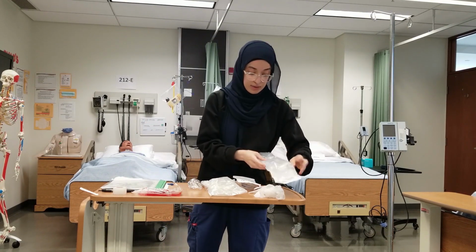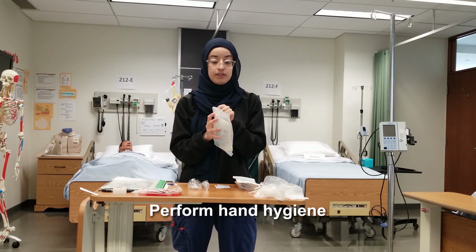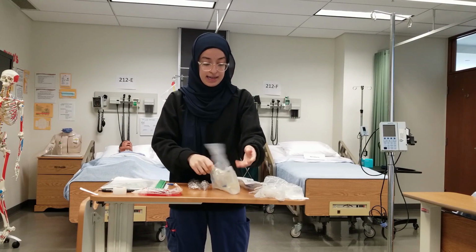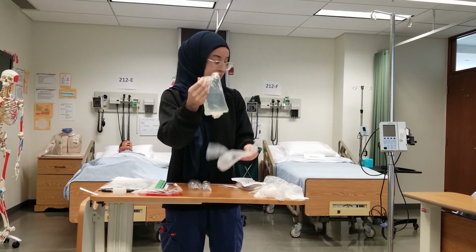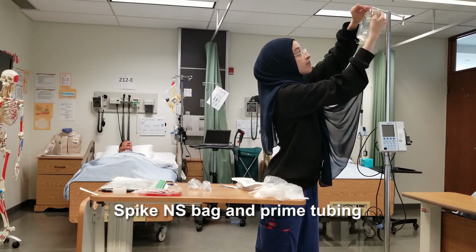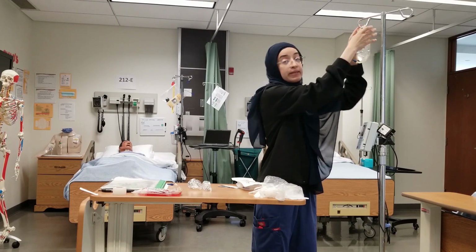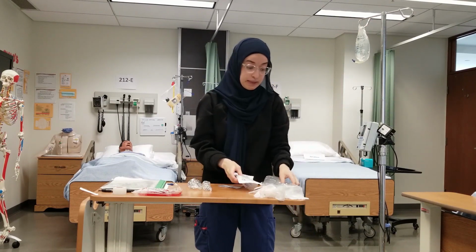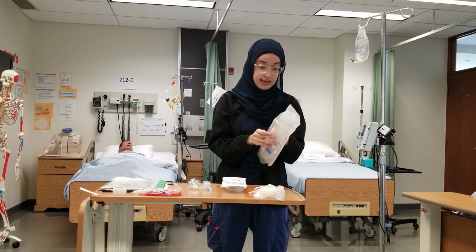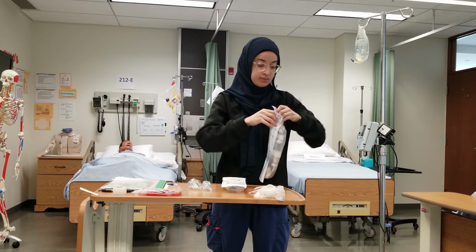So we're going to go ahead and get started. I've already performed my hand hygiene off to the side. I'm going to open up my NS and I'm going to hang it up. We want to make sure that we set this up beforehand because, again, once we get that blood product from the blood bank, we only have 20 minutes to get started. So we want to set up everything else that we can in the meantime.